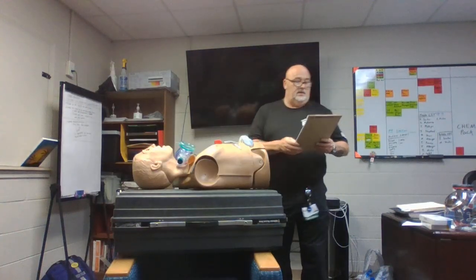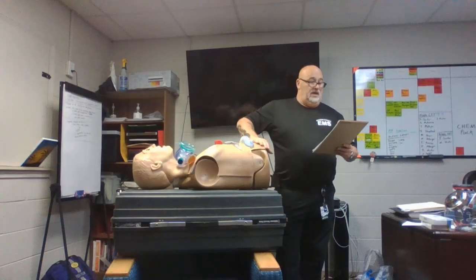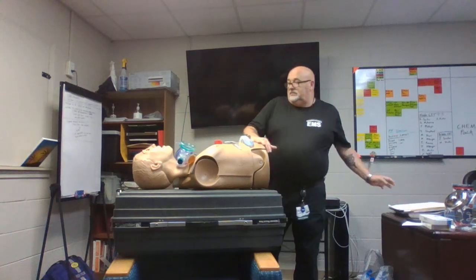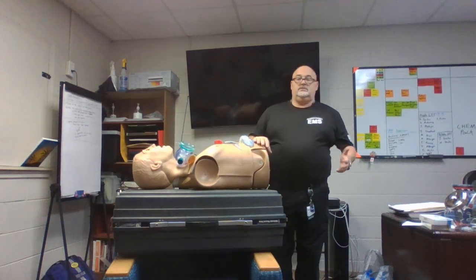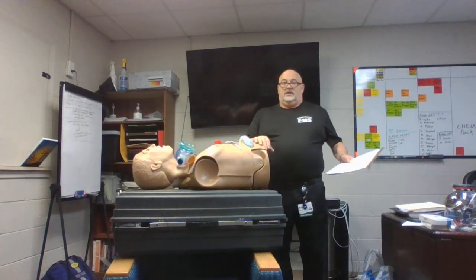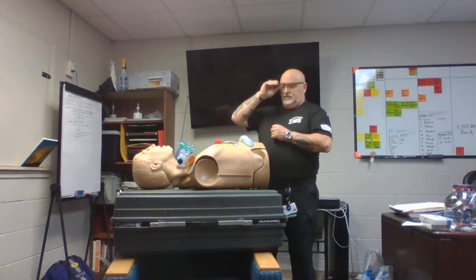Thank you. All right. First of all, we need to define the needs. Who, when, how much, and what airway management do they need? All that's based upon your assessments, correct? Devices and flow rates. What do we mean by devices and flow rates?